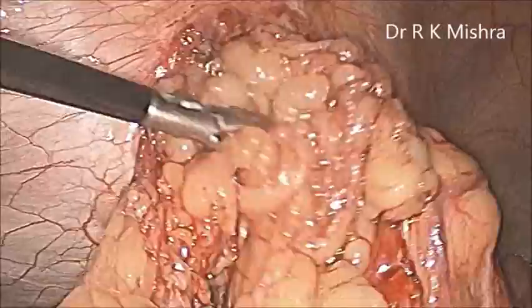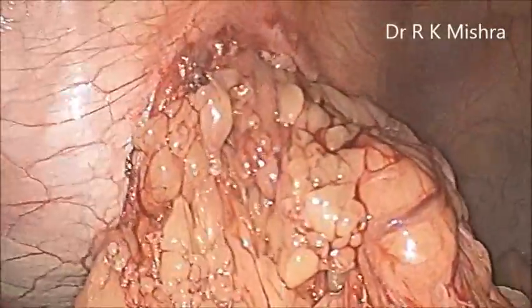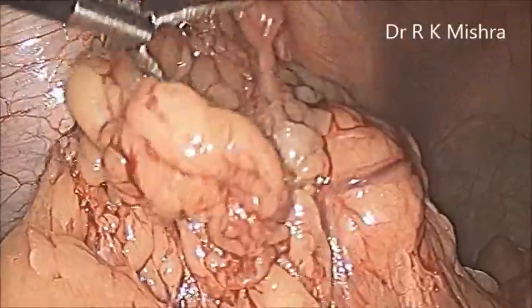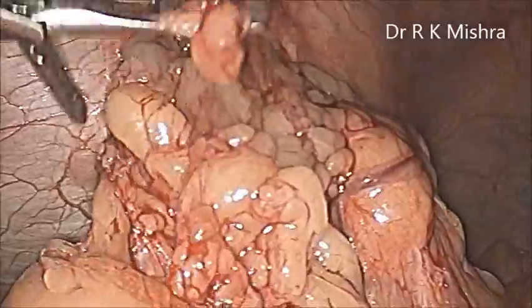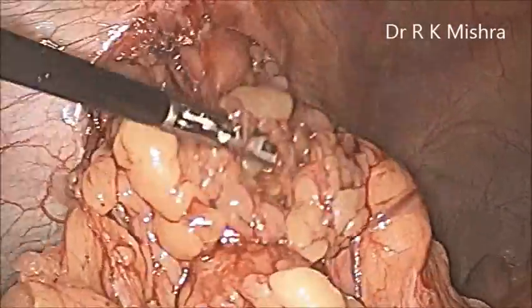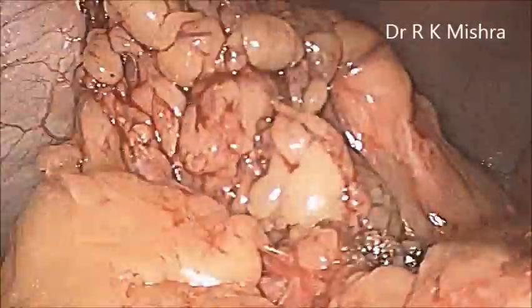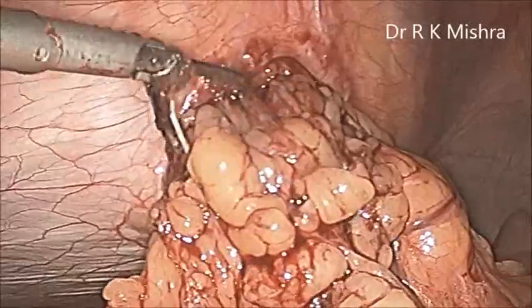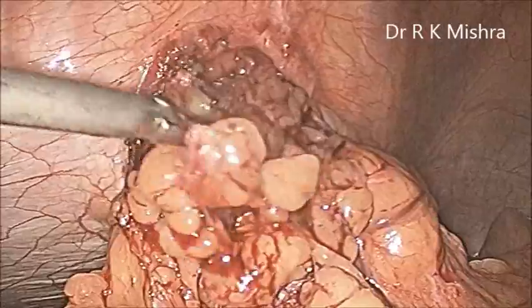Ventral hernia surgery is one of the easiest surgeries to perform by laparoscopy — especially in the onlay mesh repair. We are using Vipro also, sometimes Gore-Tex mesh, sometimes Proceed mesh. Previously before 2003, we performed hundreds of cases with simple polypropylene mesh also, which was having little chances of adhesion. But in my personal experience, even polypropylene is not a bad mesh for a poor person who cannot afford the dual-side mesh — they can use polypropylene.